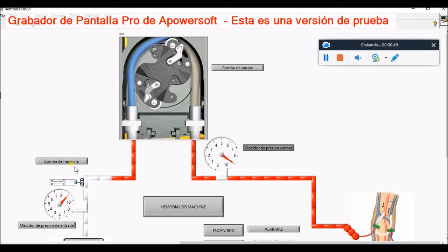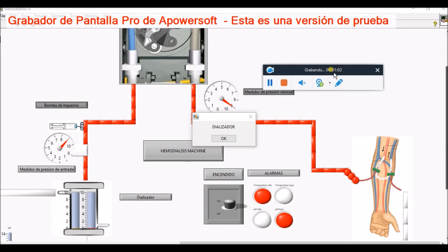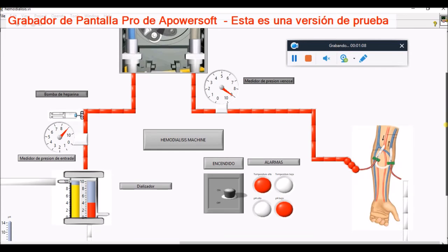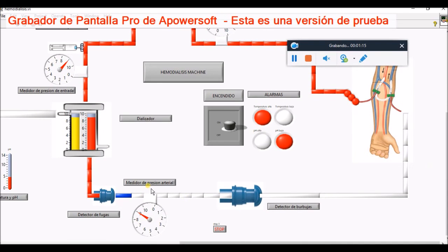Temperature sensors monitor the extracorporeal blood, ensuring that the temperature remains stable during the session. Blood may cool down as it flows extravascularly, and if the blood gets too cool, some machines may be programmed to warm the blood. Or warmers might be placed around the tubing to prevent hypothermia, especially for small infants. Cooling the blood lines can also be employed for those with fever or malignant hyperthermia.